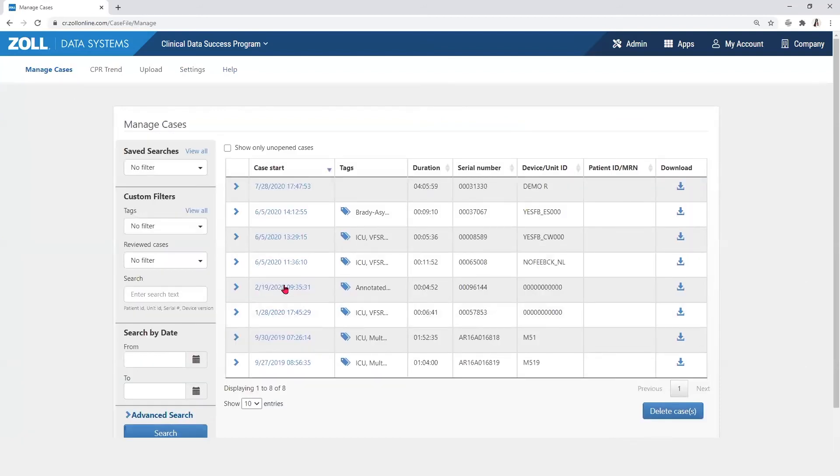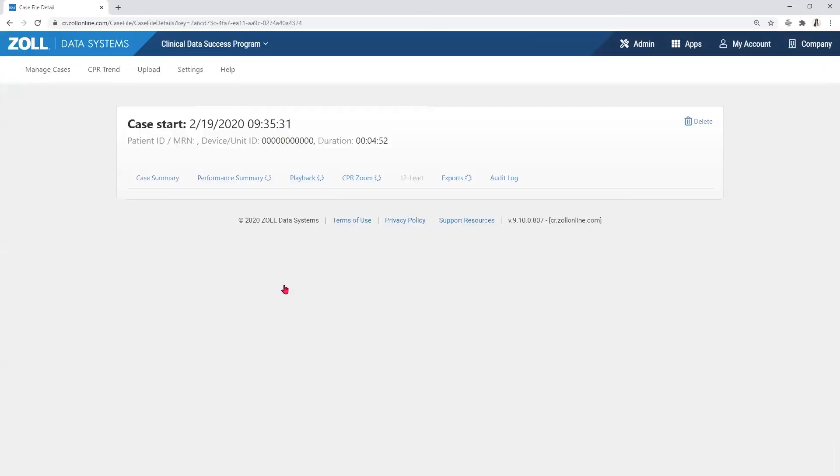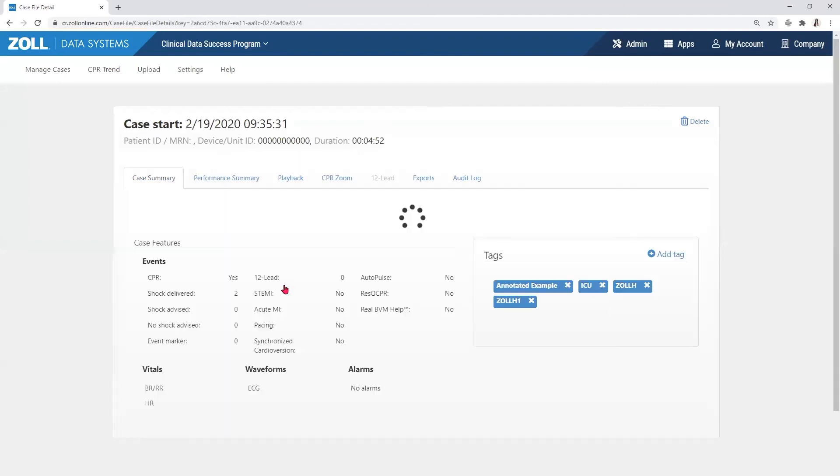The audit log can be accessed by those with access from the administrator on the Case Summary page of a particular case file.